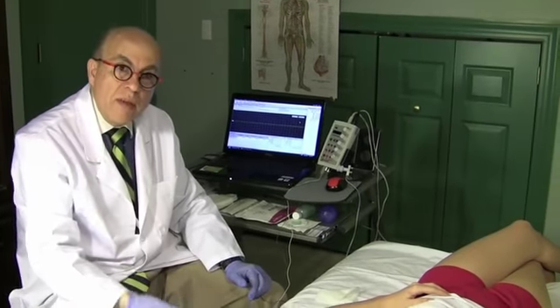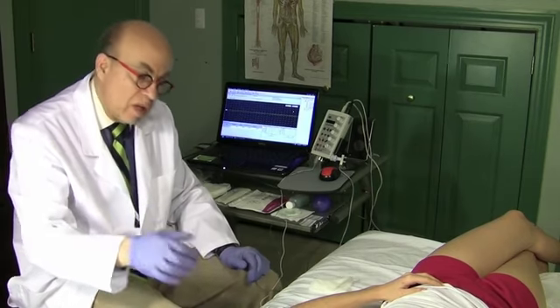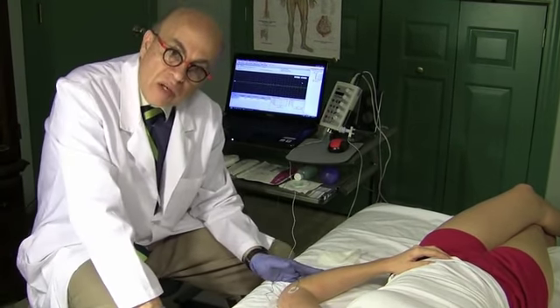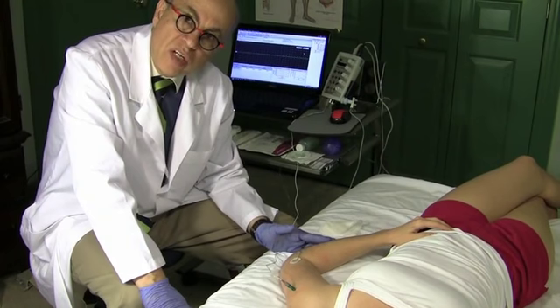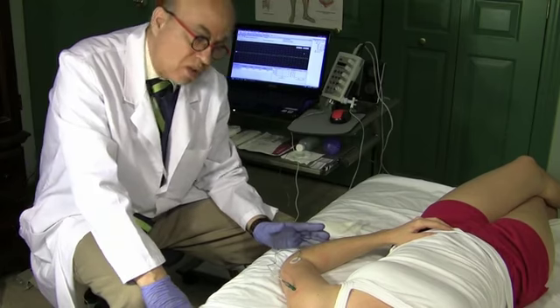If it continues, I'm either in the area where the nerve enters the muscle, or it's pathology, fibrillation, and positive waves. Obviously, you have other potentials that I'll talk about later on, and that will include fasciculation, myotonic discharges, complex repetitive discharges, or cramps, and so forth and so on. But I'll show you this in the pathological section.